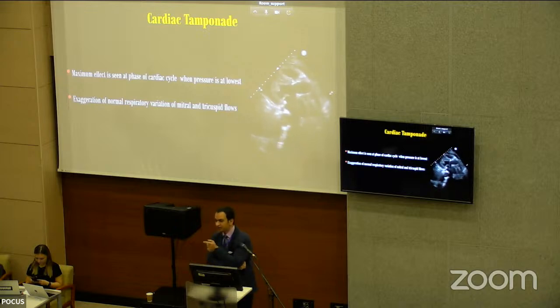Very good. Can I ask you a question before we move to the next slide? Yes. Do you see any fluid posterior to the heart in this picture?